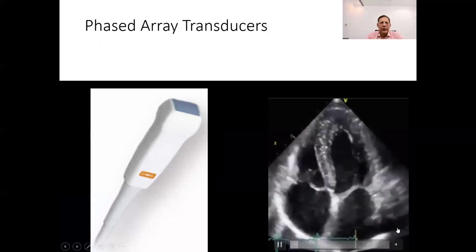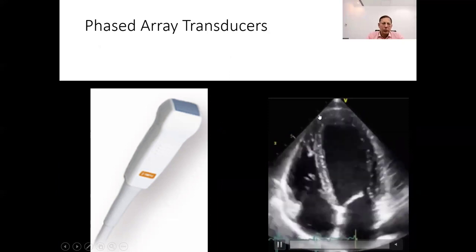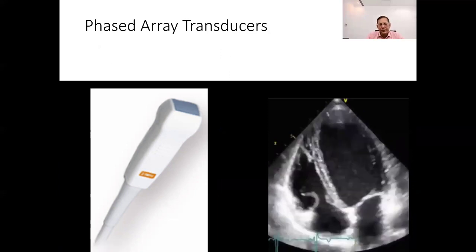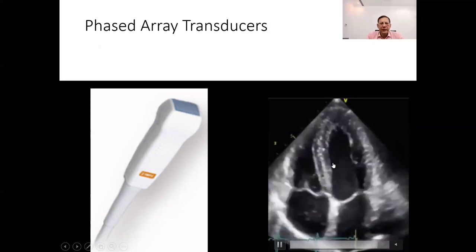The image we get from a phased array probe is similar to the one from the curvilinear transducer, in that the sound waves fan out, but due to the small footprint, their origin is very narrow. You can appreciate this in the following image.